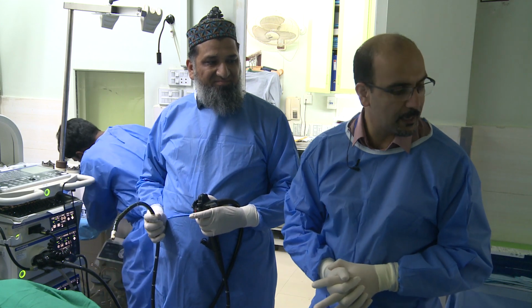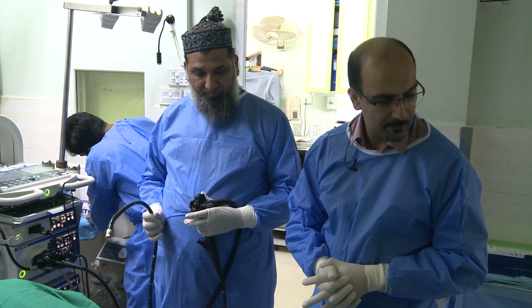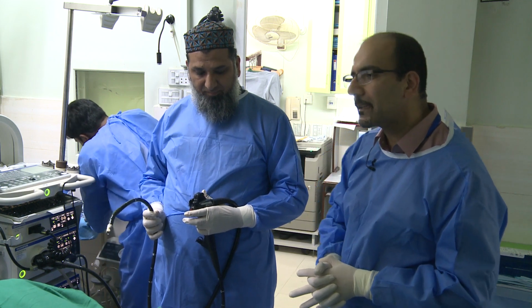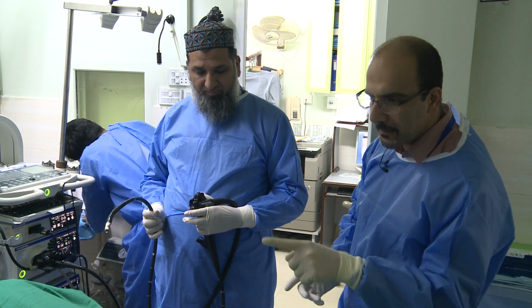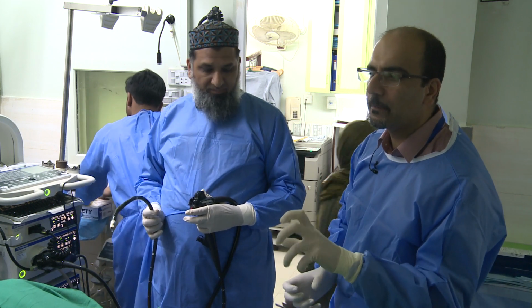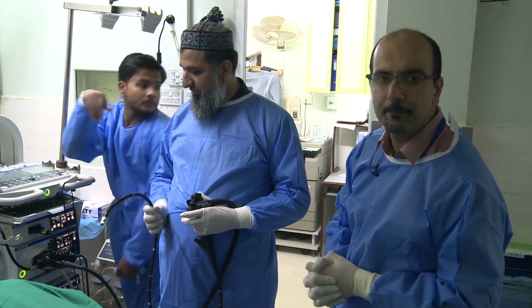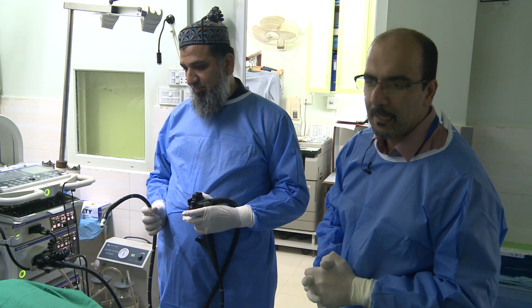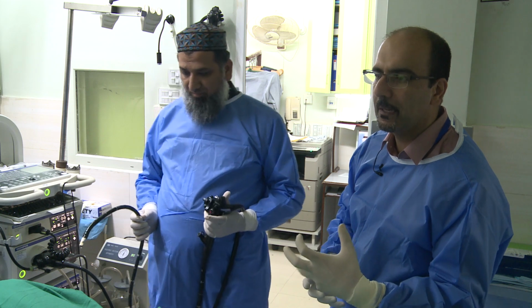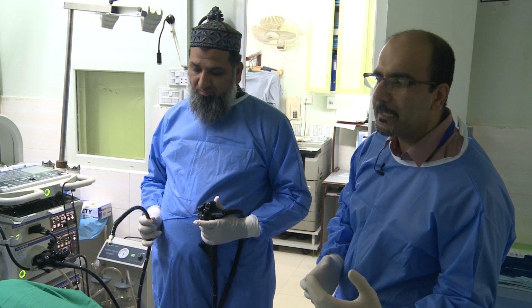Hello. Yep. So it's a periampullary mass. It had an ERCP and was stented, and now we're here to assess the ampulla. Well, I think it's more of a staging. This case was done in the last couple of days. She clearly has an ampullary tumor. Dr. Khalid did an ERCP and placed a biliary stent. It's an ulcerated infiltrating type mass involving the entire papilla and part of the second portion. So I think it's staging.